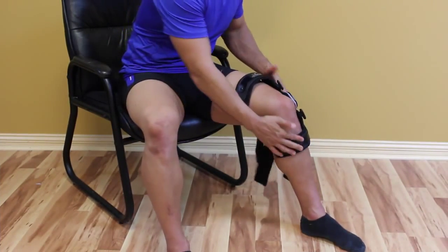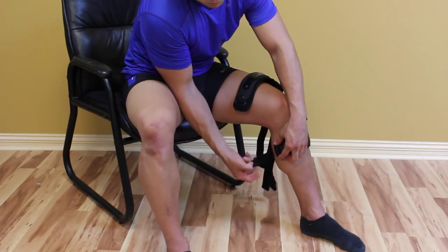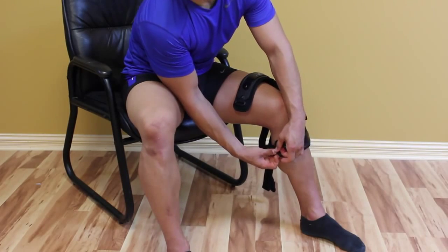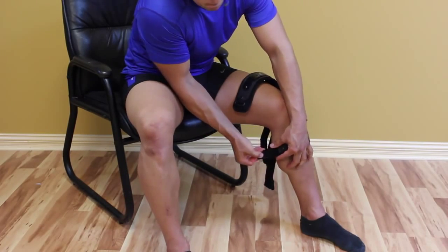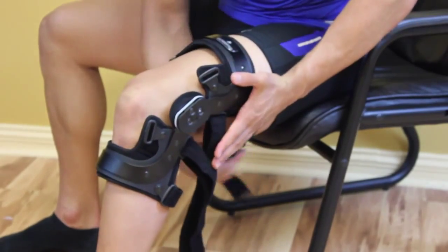Sitting on the edge of a chair, the brace should be applied with the knee at 75 degrees of flexion. Position the brace so that the center of the hinge is one inch above the joint line. When applied correctly, the center of the hinge should be level with the top of the patient's patella.